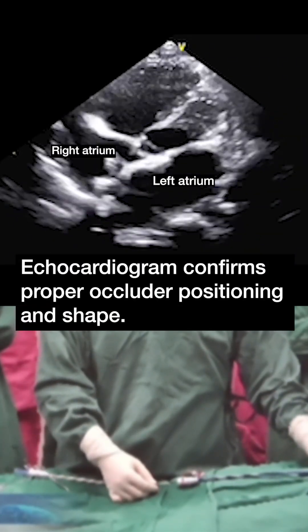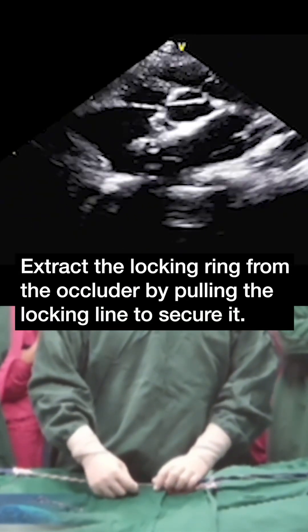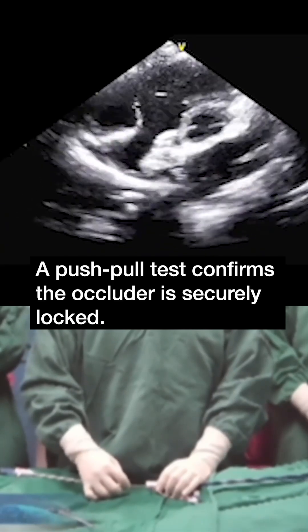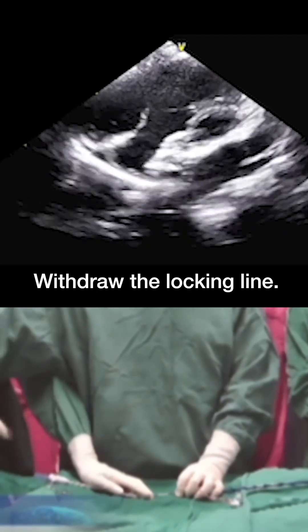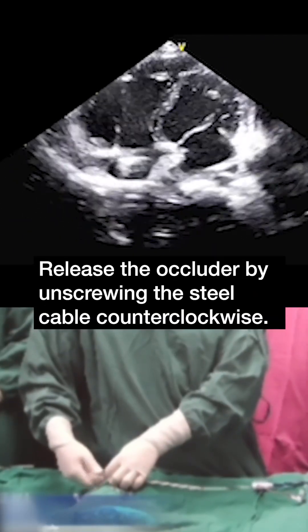The echocardiogram confirms proper occluder positioning and shape. Extract the locking ring from the occluder by pulling the locking line to secure it. A push-pull test confirms the occluder is securely locked. Withdraw the locking line. Release the occluder by unscrewing the steel cable counterclockwise.